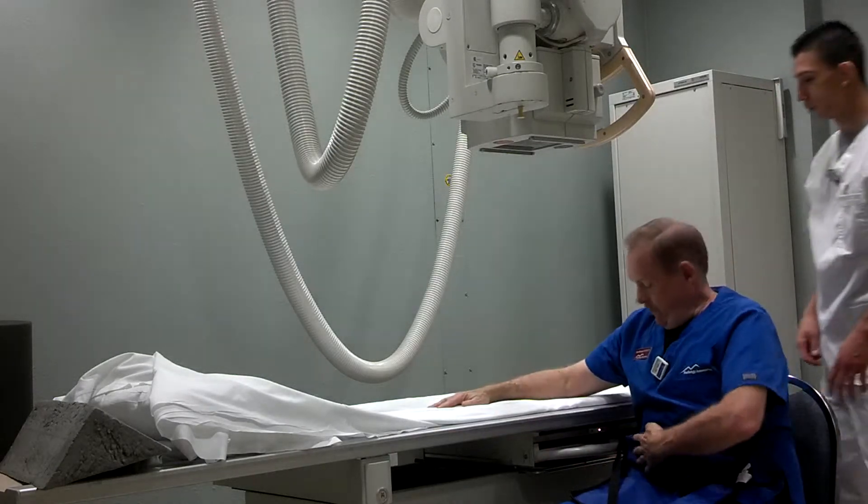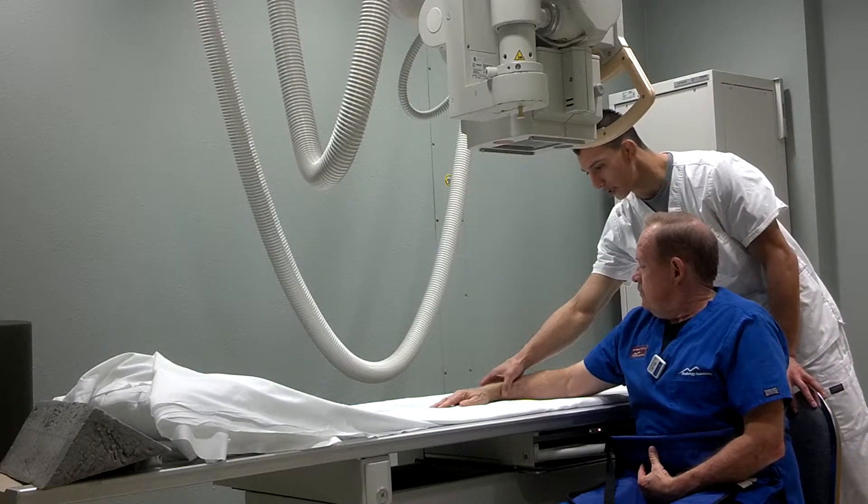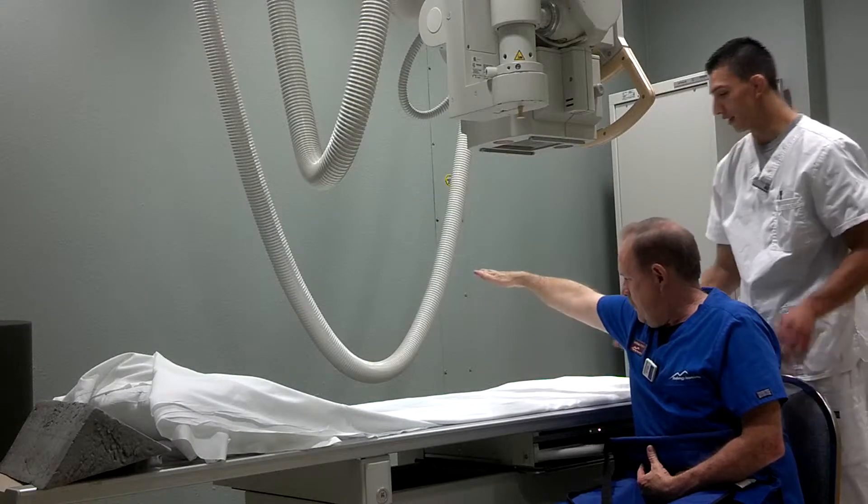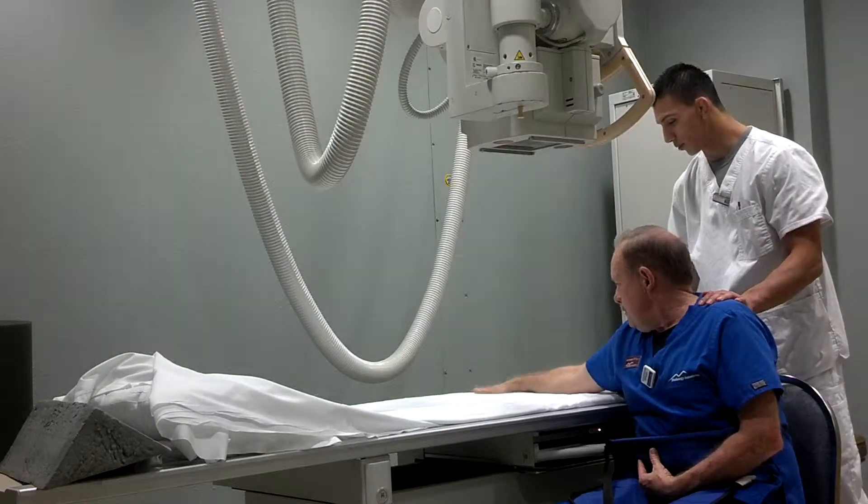Yes. Alright, so we're going to extend your arm about 90 degrees, so you're going to have it out that way — just like that. And flat down, palm down as well.